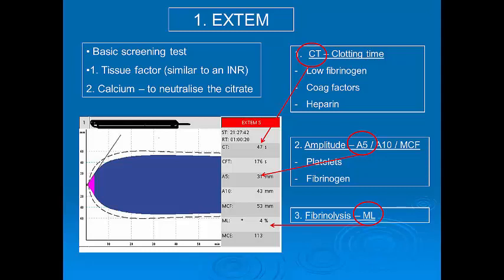The next thing we assess is overall clot strength by looking at the amplitude — measures of this are the A5, A10, or MCF. Low amplitudes are due to either low fibrinogen, low platelets, or sometimes hyperfibrinolysis. Finally, we look to assess if there is any evidence of fibrinolysis when the clot amplitude decreases over time. When severe, the shape of the temogram is immediately obvious. More subtle fibrinolysis is usually detected by looking at the ML.